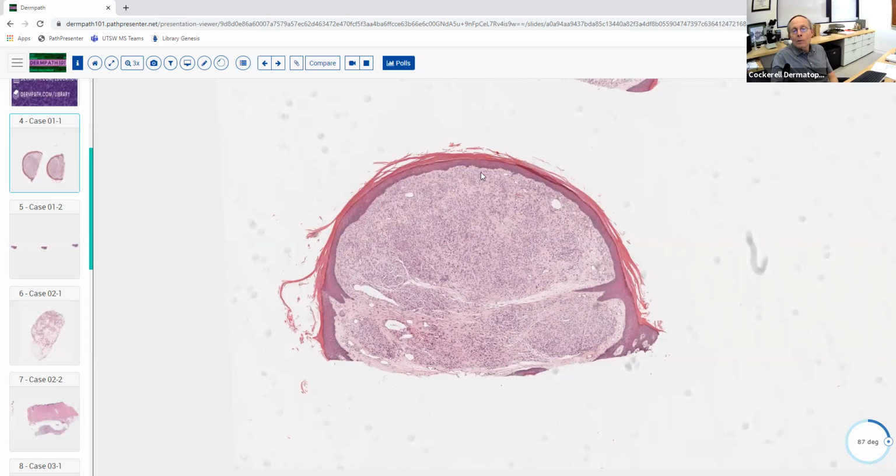You can draw a line right around the periphery of it. It's even, they've shaved it, you get to see the base here, even. So they've got some dermis beneath this. So this is the whole thing. So it's small, it's symmetrical, well circumscribed, so it's almost certainly going to be benign. Now, there are exceptions to those rules, like metastases can sometimes be small, symmetrical, well circumscribed. They can kind of fool you. But the vast majority of the time we see this, we favor benign.